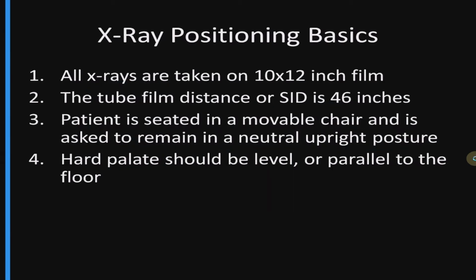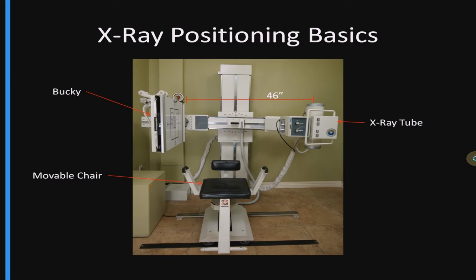Our X-rays are taken on a 10 by 12 inch film at a source image distance of 46 inches. The patient is seated in a movable chair in an upright, neutral posture with their hard palate level.